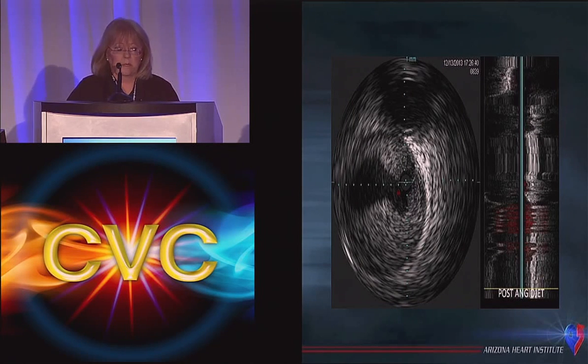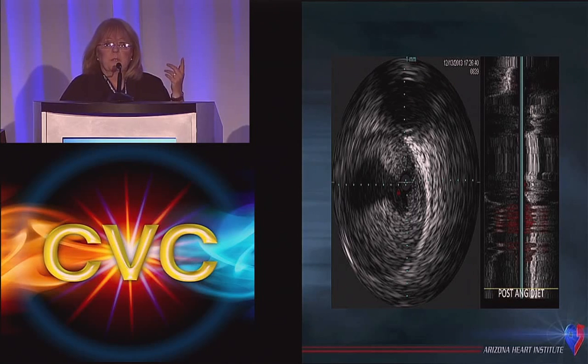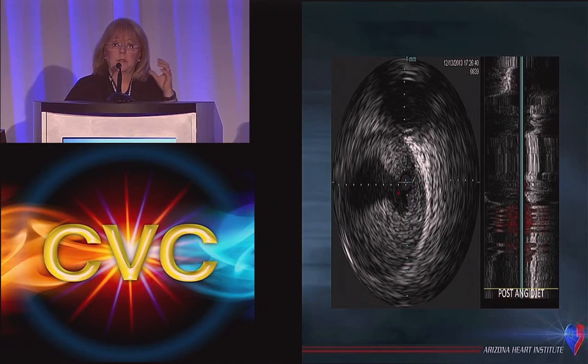But the important part is this. Following trellis, I want you to see what it looks like. This happens to be after AngioJet and trellis. This was completely occluded acute thrombus, and this is after an AngioJet procedure. It shows a kind of divot in the thrombus, and the thrombus is completely attached to the wall. So all you get from the AngioJet and the trellis is a little bit of debulking in the center of the lumen, and then you seed the clot with the death knell of more TPA just sitting there, so it dissolves after you even do the procedure.